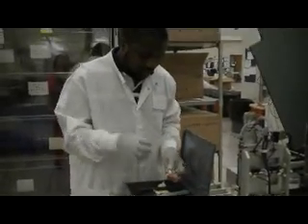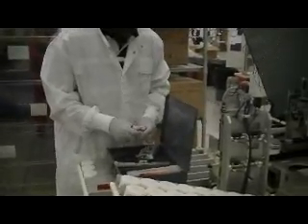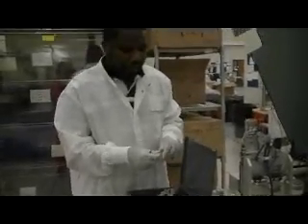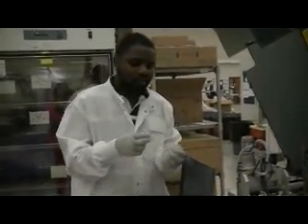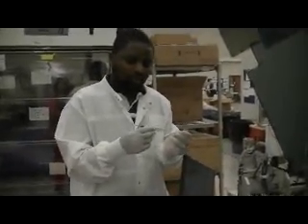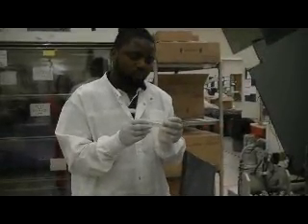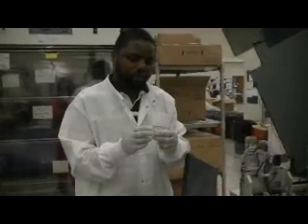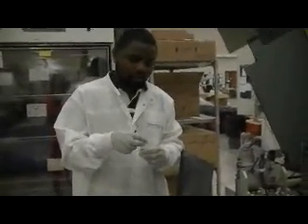And this is the calibration tool that you use to calibrate your loops, depending on what type of cultures you are going to streak. Usually on this one we just use 0.1. So you use this to make sure that your loops are calibrated, so that you collect the correct amount of specimen when it dips into the urine.